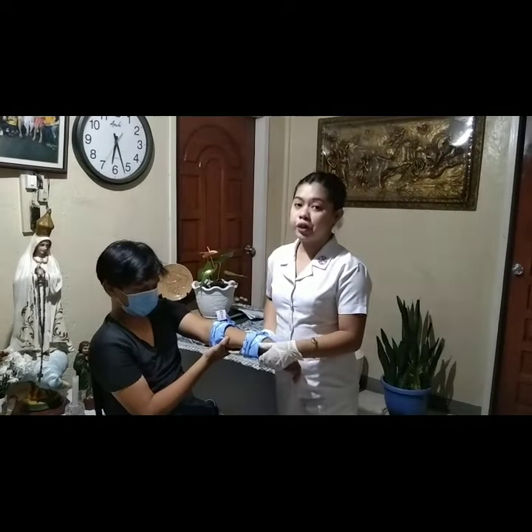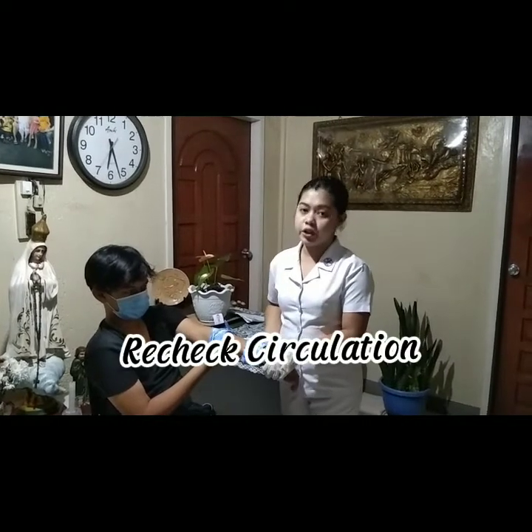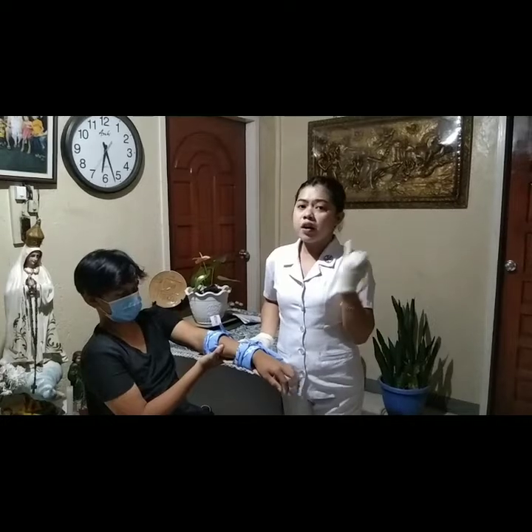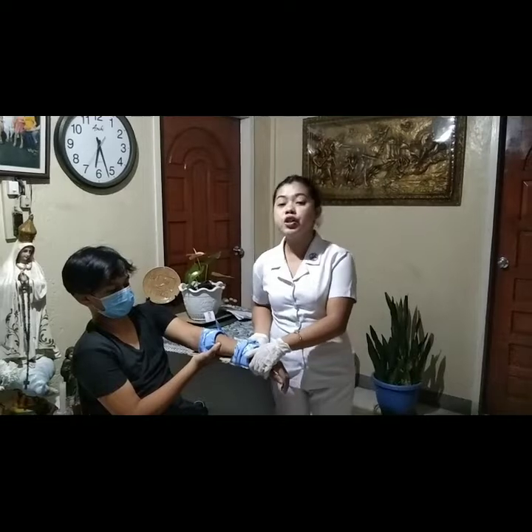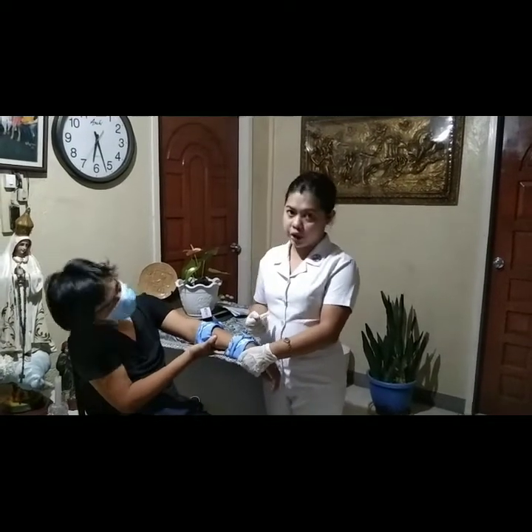After securing the bandages, let us now recheck the circulation. We should check again for the feeling, for the warmth, and of course for the color. This will ensure that the bandages are not too tight as to block circulation.